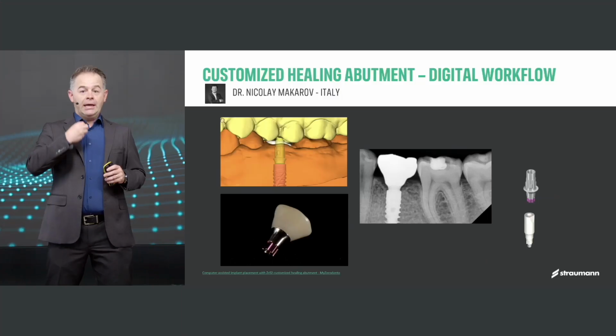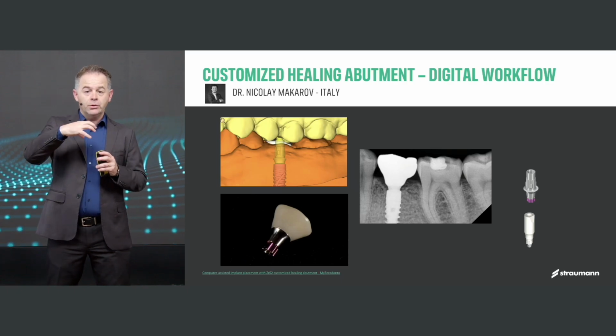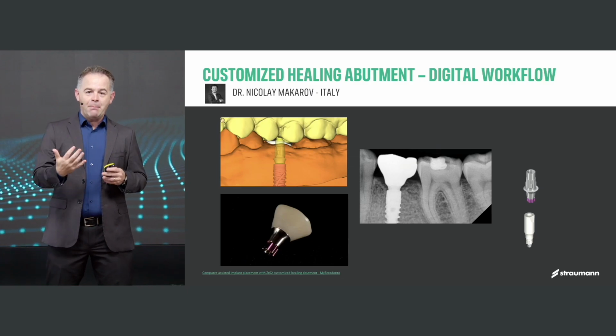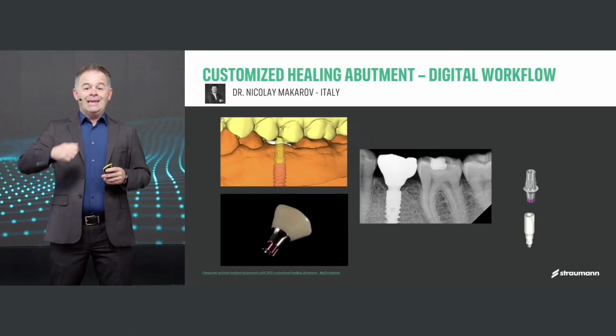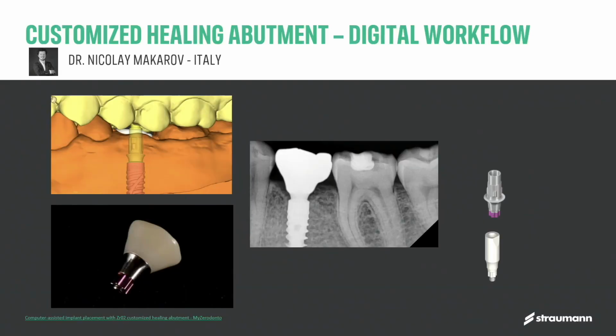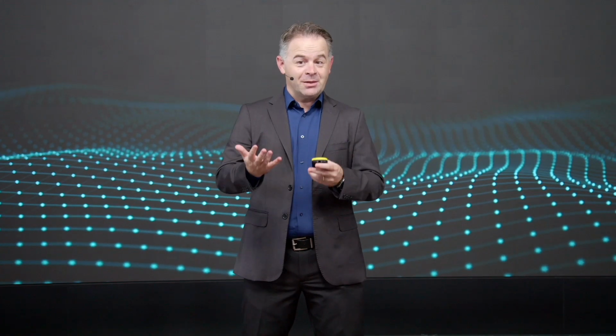However, this increases cost, because keep in mind, you're going to have an abutment, and then you need something to mill and cement onto this abutment, and invariably towards the end, you're going to need a scan body to scan that site. So you have to remove this part, scan that site, and then shift towards the final prosthesis. Again, this increases cost, this increases a lot of chairside time, and increases the overall time to teeth, which the patient is also a bit anxious about.